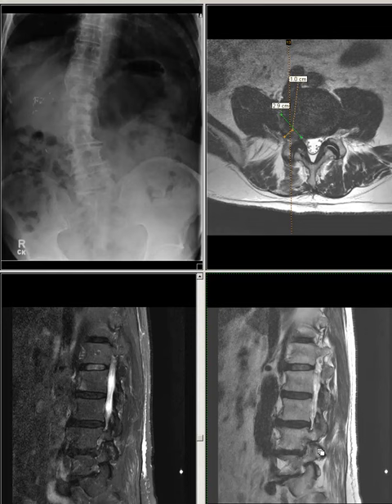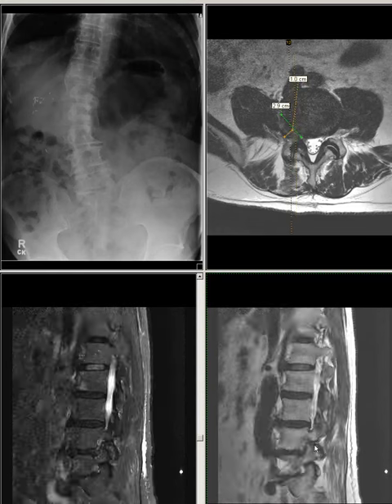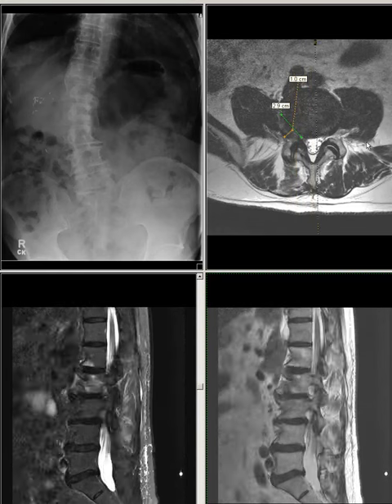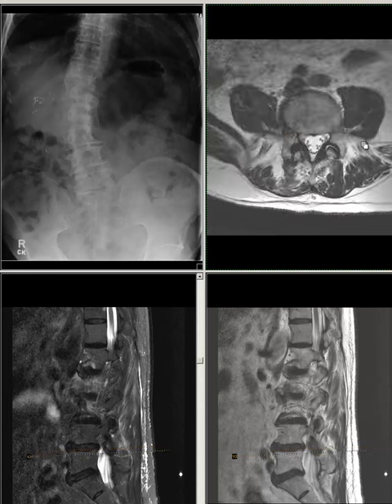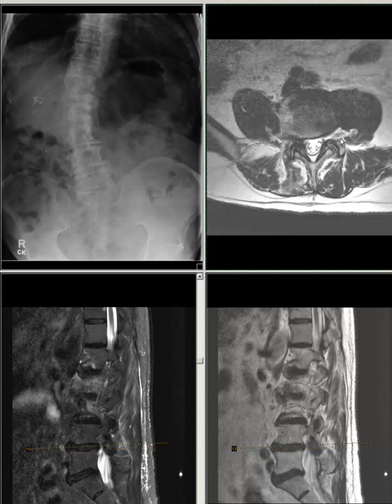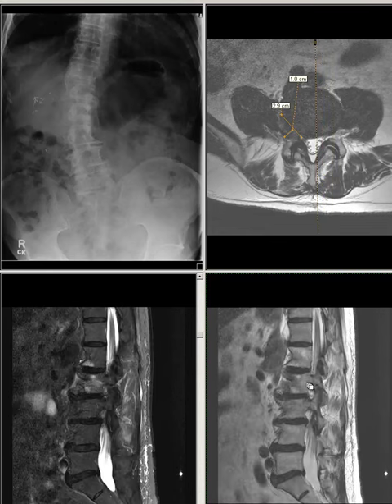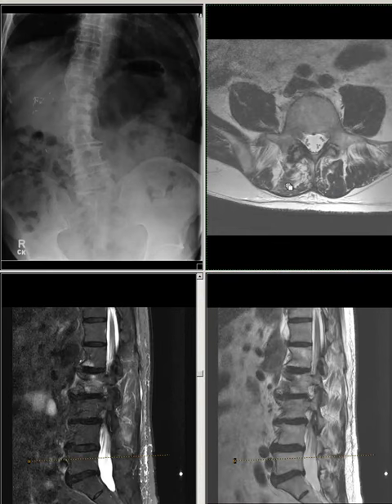It results in moderate to severe right-side neuroforaminal stenosis with effacement of neuroforaminal fat and probable compression of the exiting right L4 nerve. This is primarily due to disc-osteophyte complex protrusion and facet joint hypertrophy. Right-side facet joint arthropathy is noted, more prominent compared to the left side. No evidence of spinal canal stenosis. The left-side neuroforamen is patent.